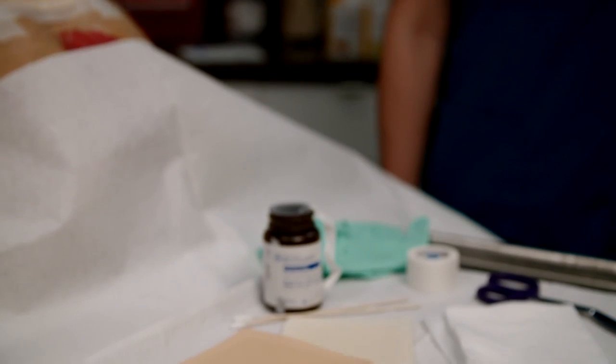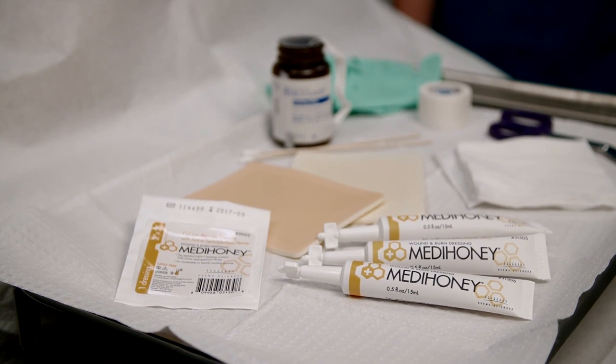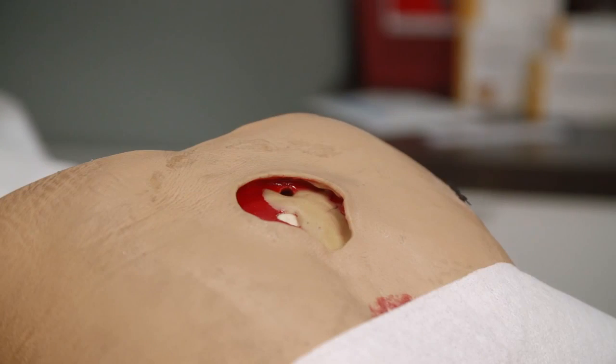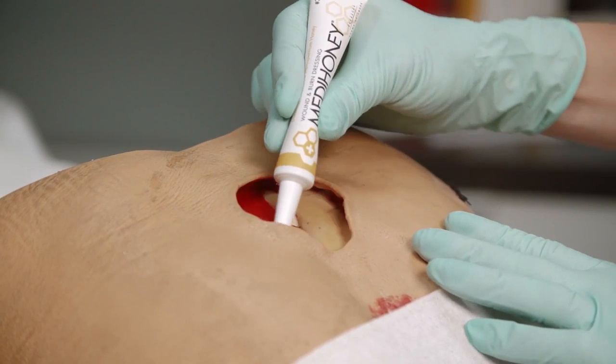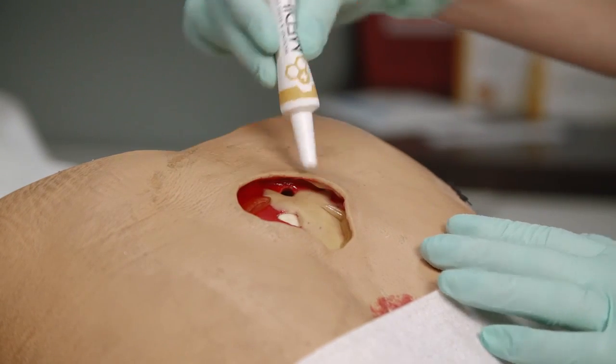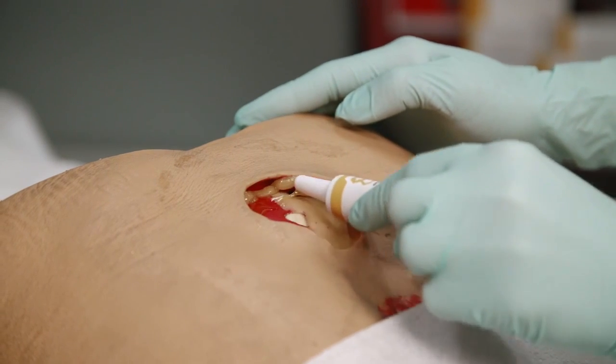It is recommended to use Medihoney paste with a secondary cover dressing, except in cases like certain burns or mouth wounds where your clinical judgment comes into play. As we demonstrate on this model of a sacral pressure ulcer, after properly cleaning and preparing the wound, Medihoney paste can be applied directly to the wound bed.